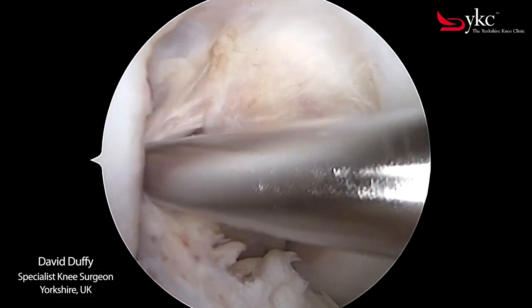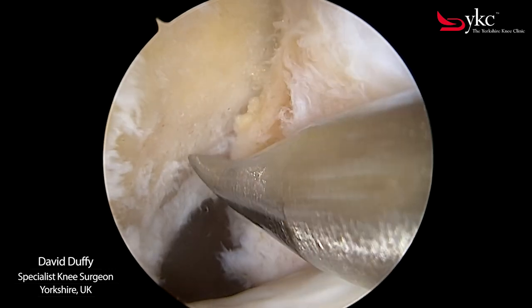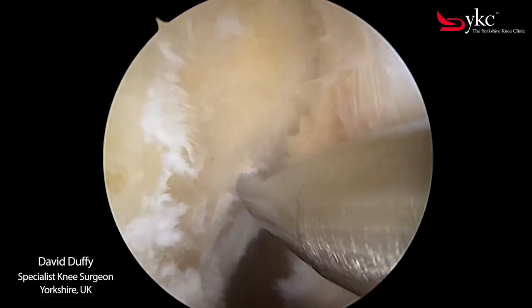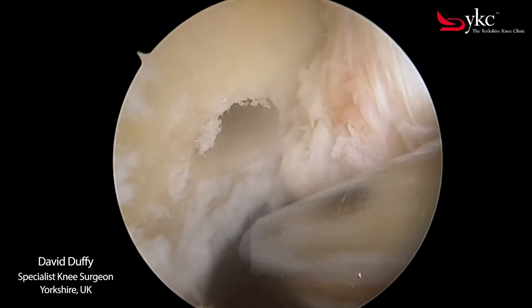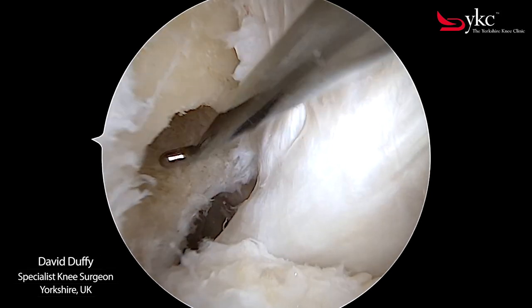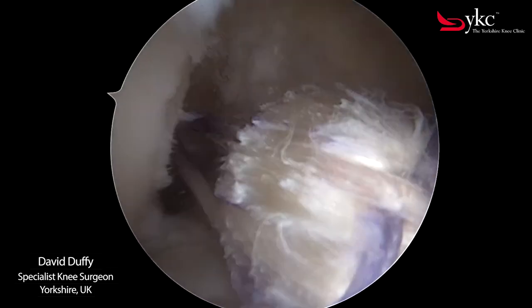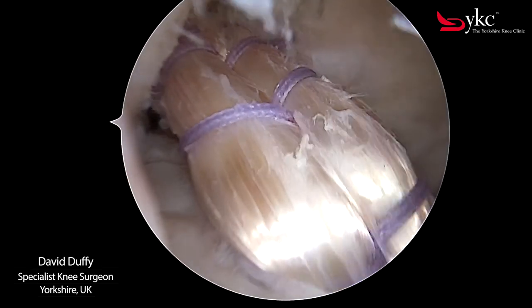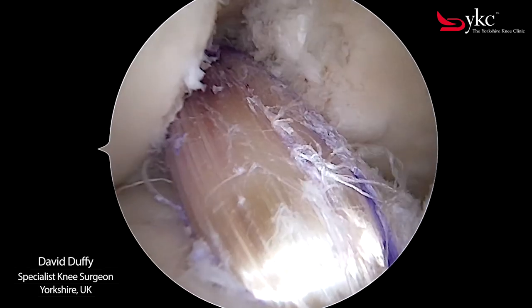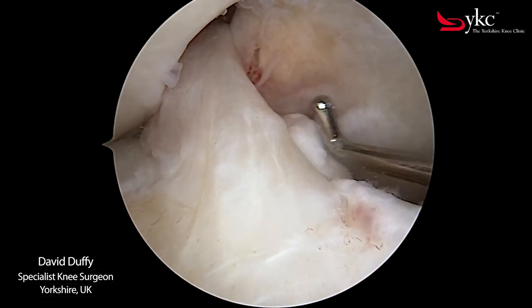During the operation, I remove the old torn ligament. The attachment points to the femur and tibia are identified for the new graft. Sockets are created into which the new graft will insert. I pull the graft across the joint, inserting it into the socket. Here is the reconstructed graft, compared to a normal healthy ligament.